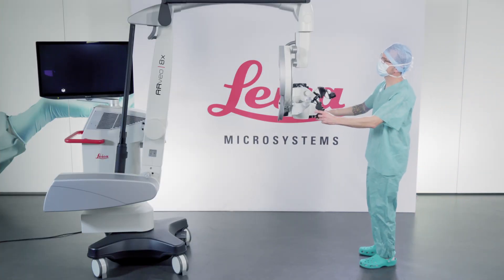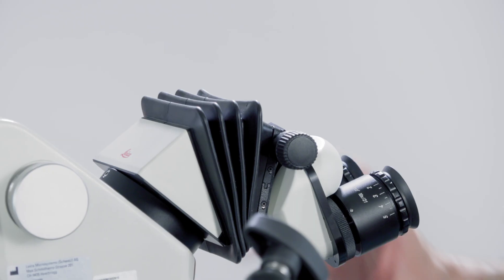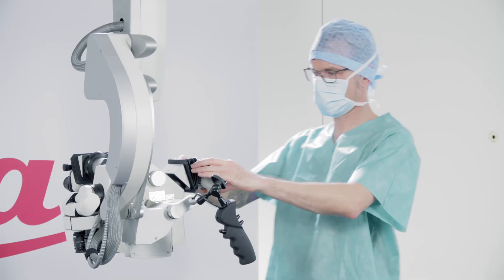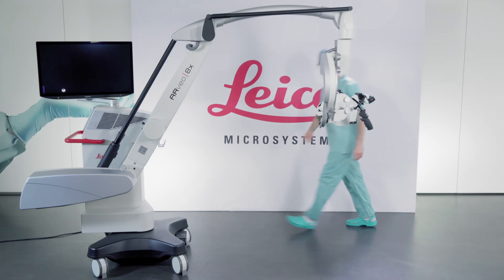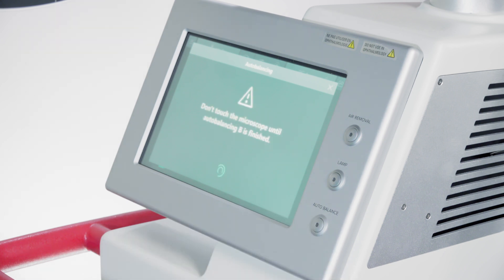Before draping the microscope, lower the horizontal arm of the microscope for easier access and make sure the binocular tubes are set in the correct position for the surgical procedure. Check that the balancing has been done properly.